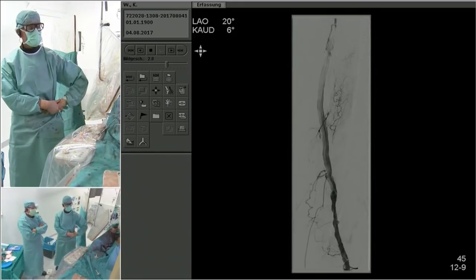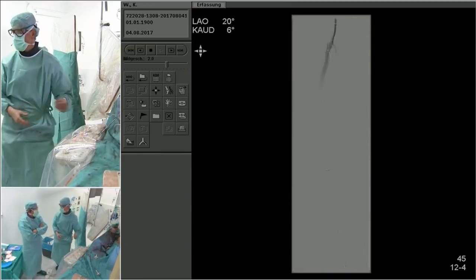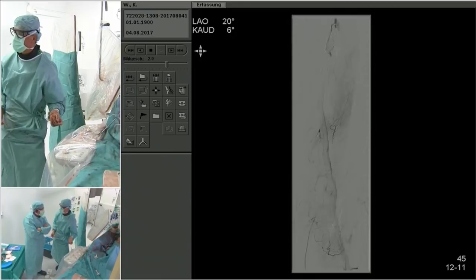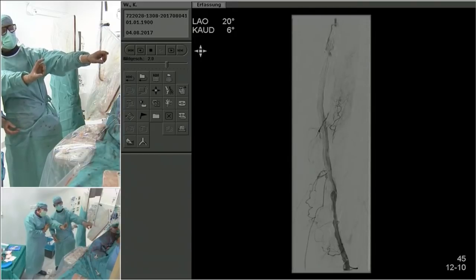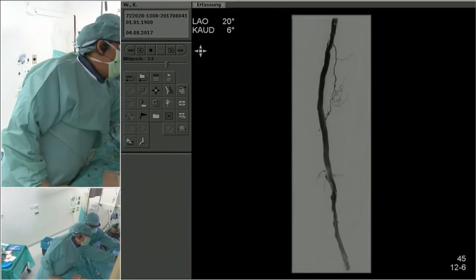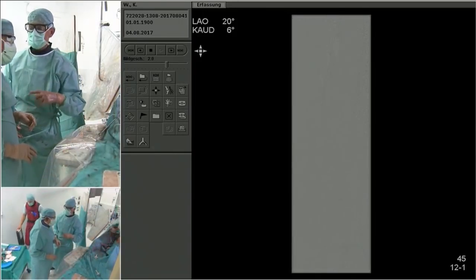John? Yeah, definitely DCB. And I'm looking at this, and I don't know how about you guys, but as I'm in the cath lab, every time they're opening a package, I'm getting chest pains. Another stent. We'd go with DCB. You know, there's a pass-through in the United States. You do distal, you do proximal. I think it'll look great. And we've talked about this even in various SABs, accepting a little bit of dissection with DCB because they remodel nicely. So how many of you will actually leave it?